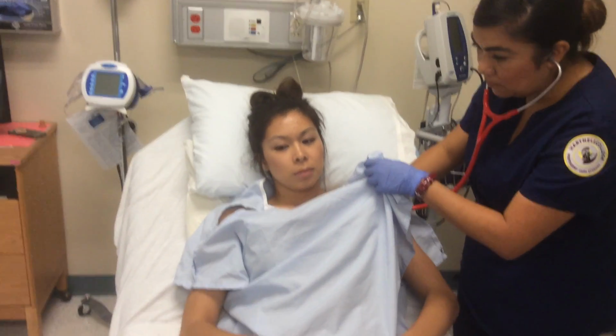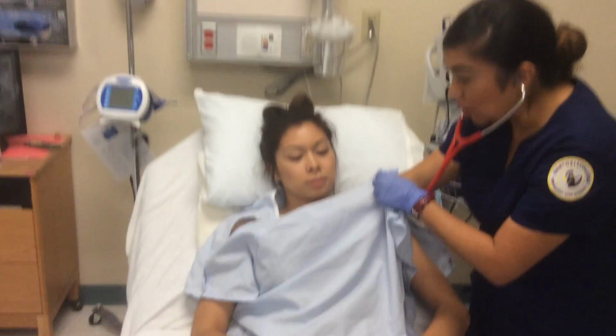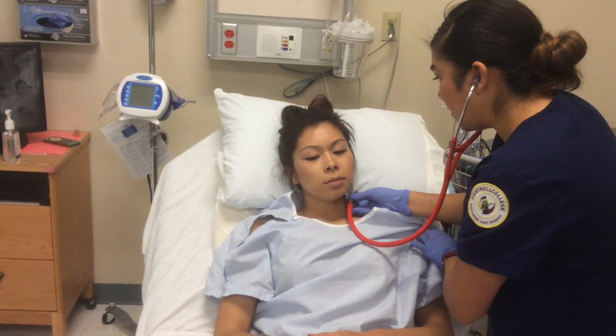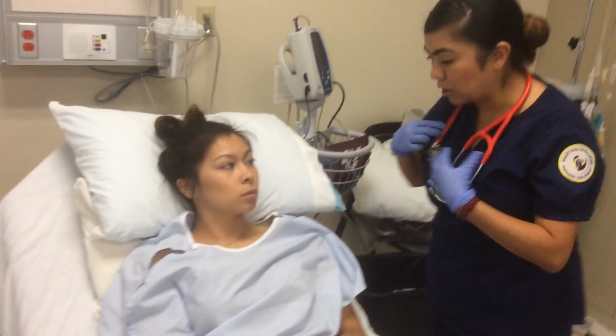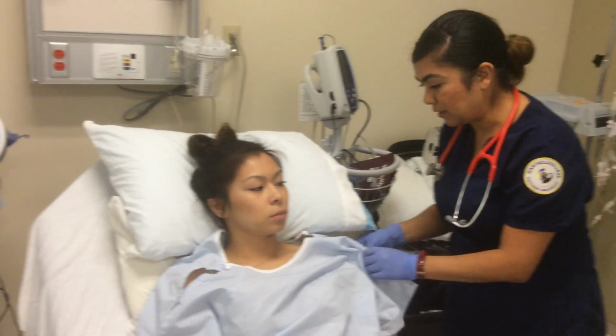Almost done. Perfect. Are you feeling good? Okay. Very good. One more. And it's going to be right here. Very good. Thank you. So the reason that I checked her neck was I just wanted to make sure I didn't listen for any stridor. In this case, there was none.